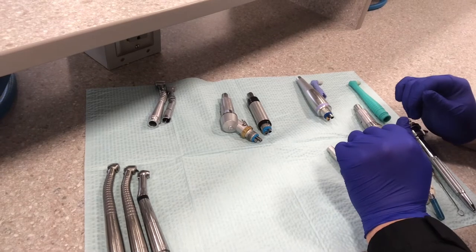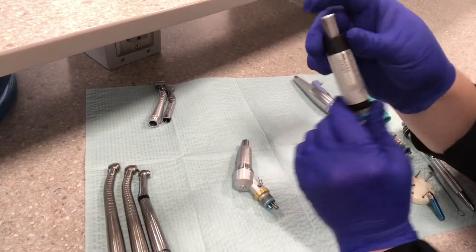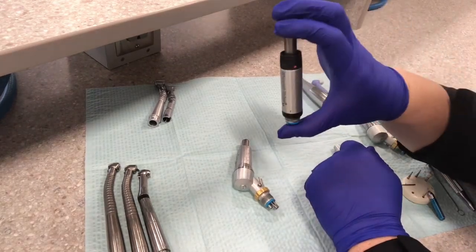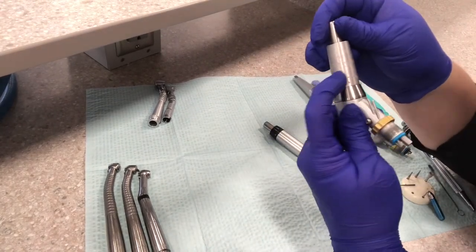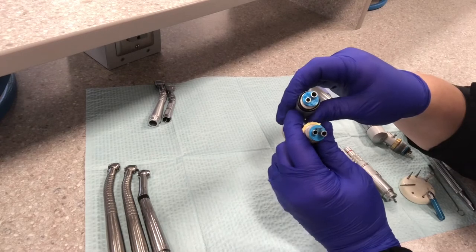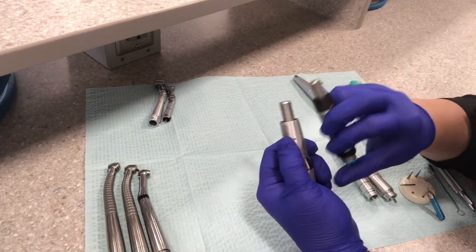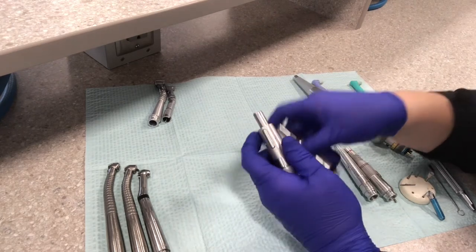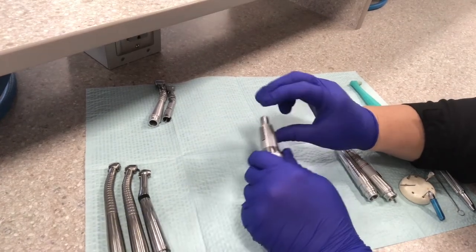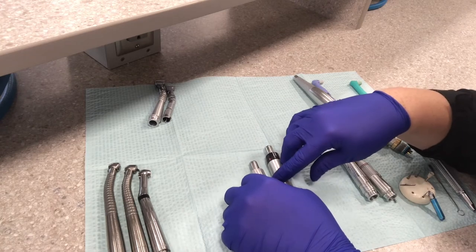Next, we're going to talk about the slow speed motors. There are a couple of different ones. This one literally says the type of motor it is — it's a Midwest Rhino, and it's a straight motor. Then this one says 'shorty' — it looks kind of like a little gun. These hook right into the hose in the operatory. They do not have water that works with the slow speed motor; there's no water when you use the slow speed. It's slow speed because it moves slower — the RPMs are much less than the high speed, so it removes tooth structure a lot slower. It's good for polishing or decay removal that's getting close to the pulp or the nerve of the tooth.